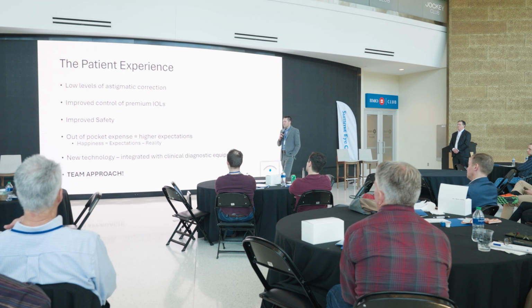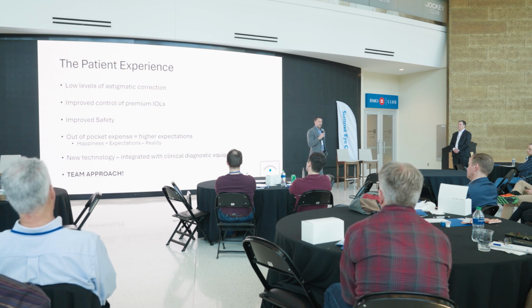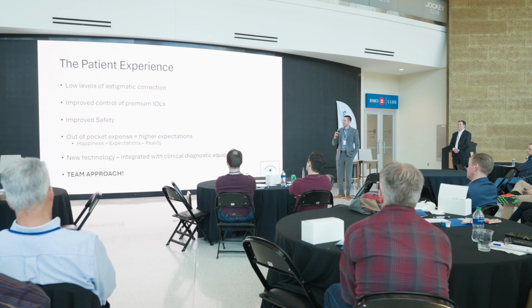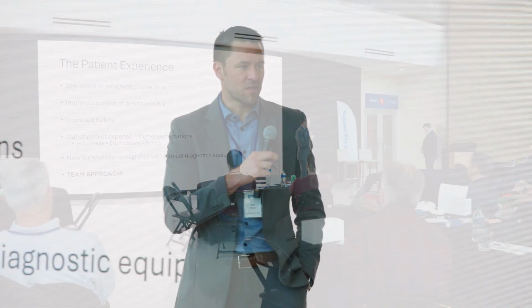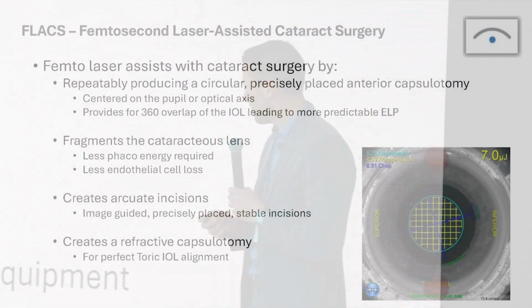Our technology is now fully integrated into our clinic. All of our biometry talks to the operating room. Everything is completely integrated, and it's really a team approach. Like Dr. Vukich and I work in clinic, it's all about dealing with the same patient pre- and post-operatively. The debate that we had earlier, we have that debate every day: which kind of lens is really a good option for this patient? How do we handle this patient? What kind of things are we looking for post-operatively? So it's really, truly a team approach.